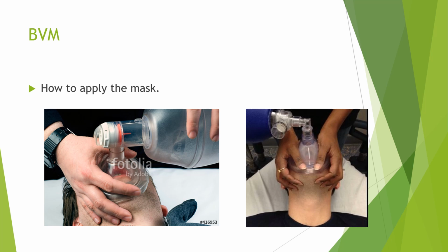So here is the picture of how to apply the mask. Remember, properly sealing the mask with the patient's face is very essential to the usage of BVM.